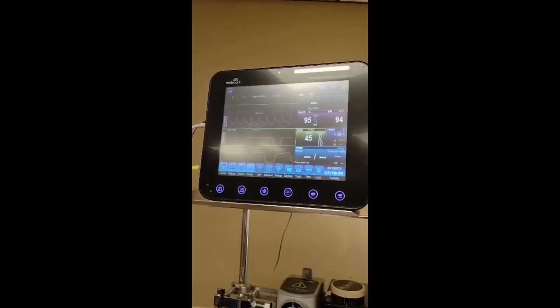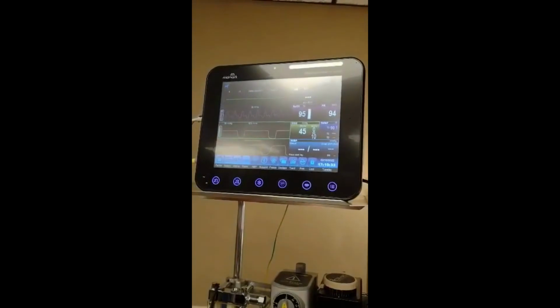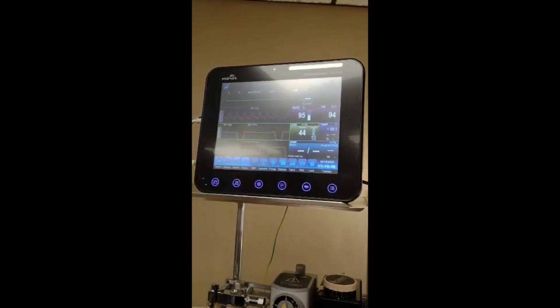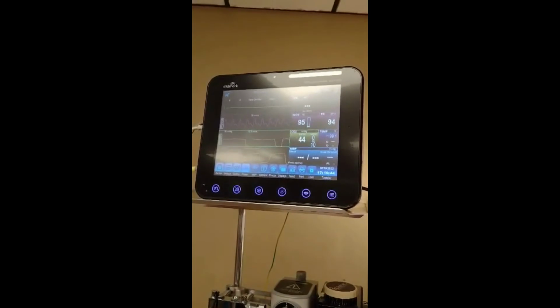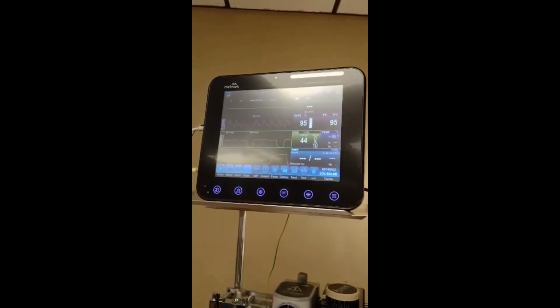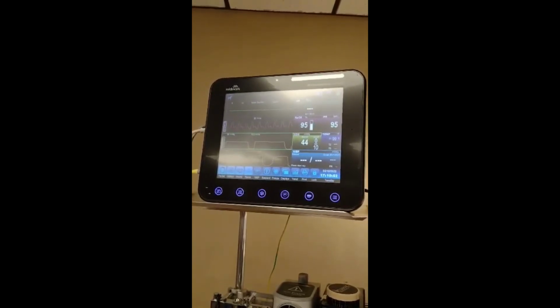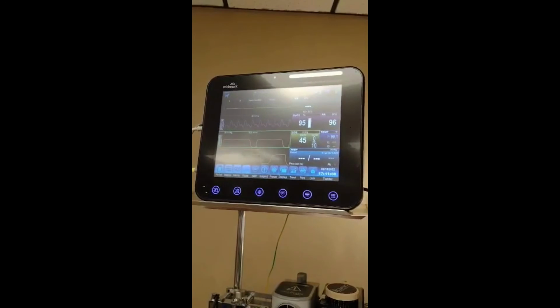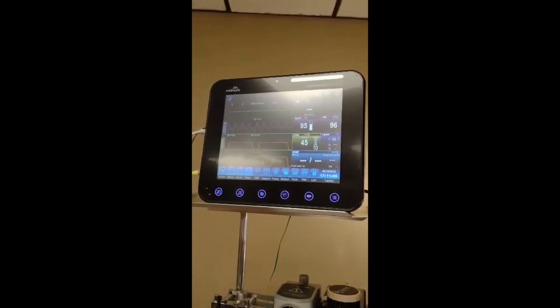If you had a patient that you were doing CPR with, this is going to be much lower than that. You should be achieving at least a 10 end tidal, and again maintaining a 0 in. But for better outcomes, you really should be getting up to about a 20 end tidal CO2. If you're not hitting that 20, you should be tweaking how you're performing your compressions, because although this is telling us about the amount of carbon dioxide we're inhaling and exhaling, that is going to be a direct relation to how well our patient is perfused and how her circulation is.